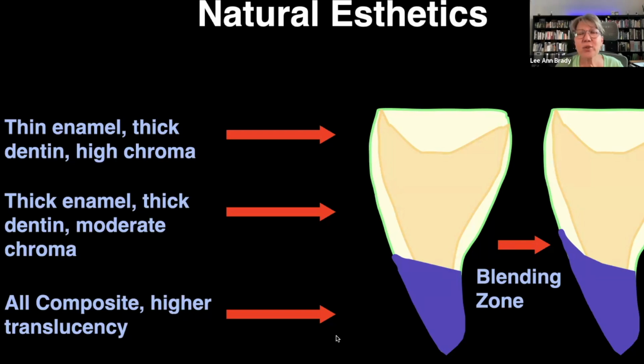So not only are we going to use a long bevel to help with this, but then we're going to think about when we're actually etching. And so on the labial of a tooth in the aesthetic zone, I actually etch the entire labial. I don't even think to worry about where's my margin end, where does my bevel end. I want phosphoric acid if you're using that, or your self-etching adhesive, I want it to go way beyond where my margin stops based on the prep. And literally to me, I just do the entire labial surface.